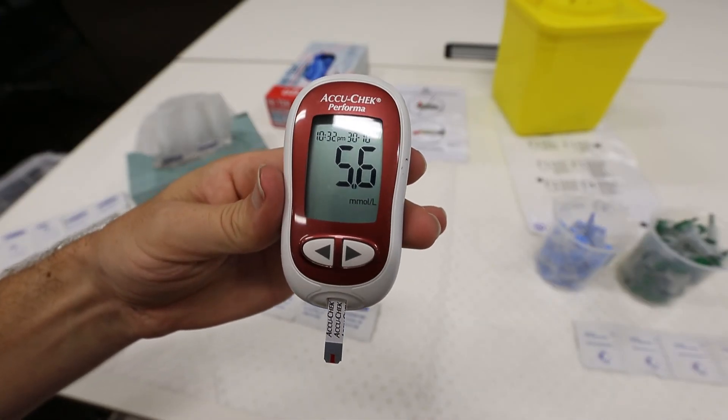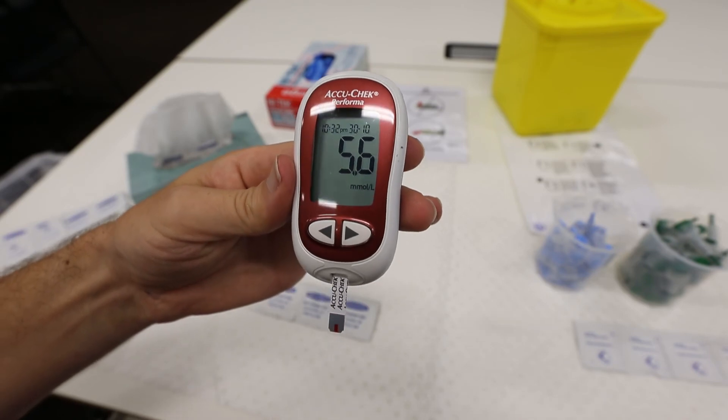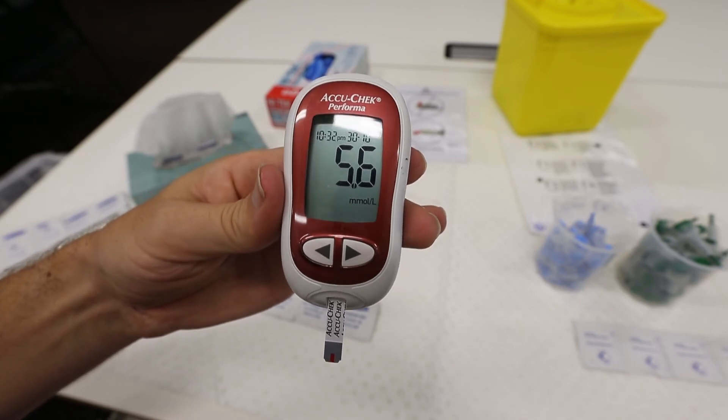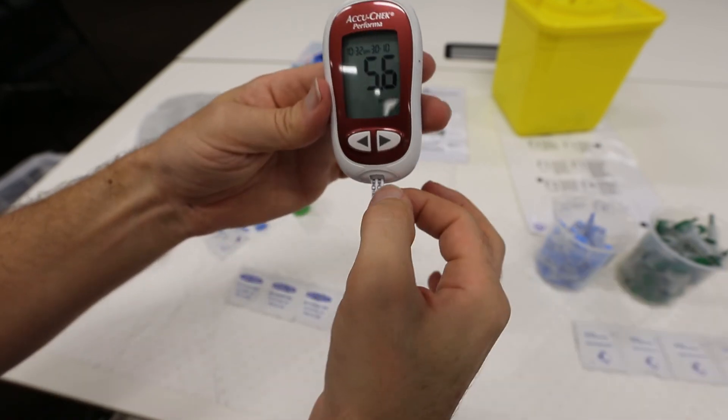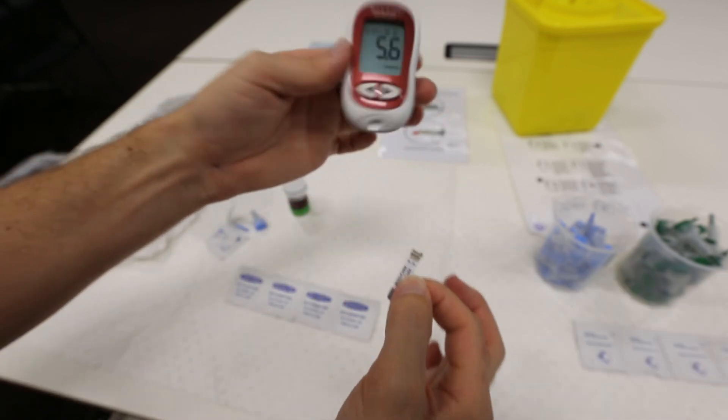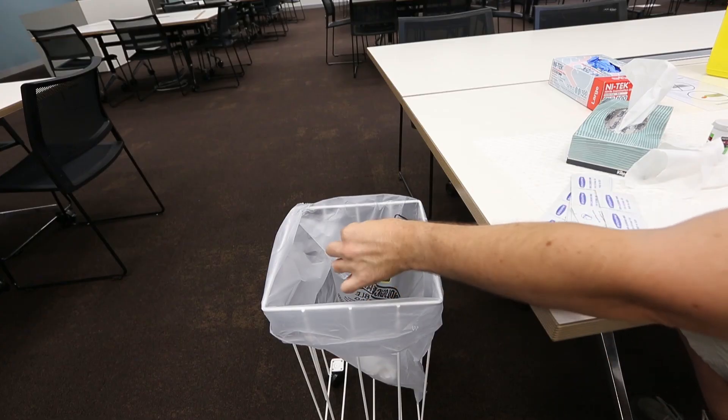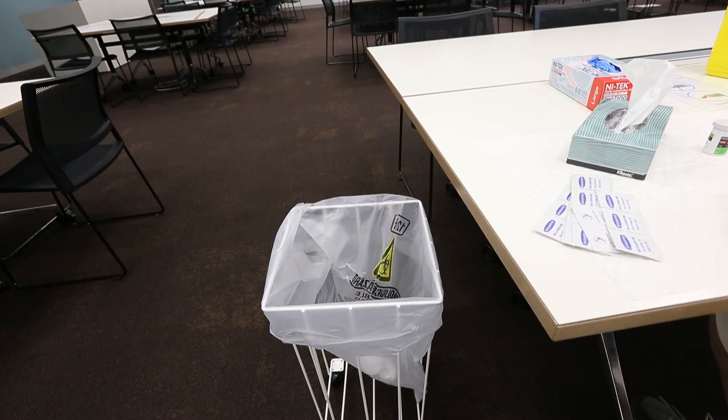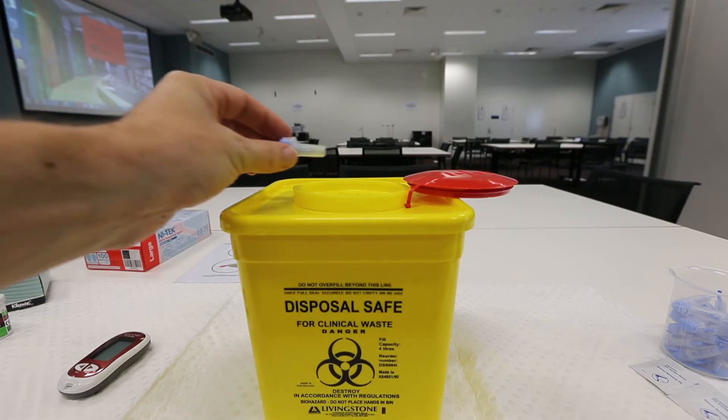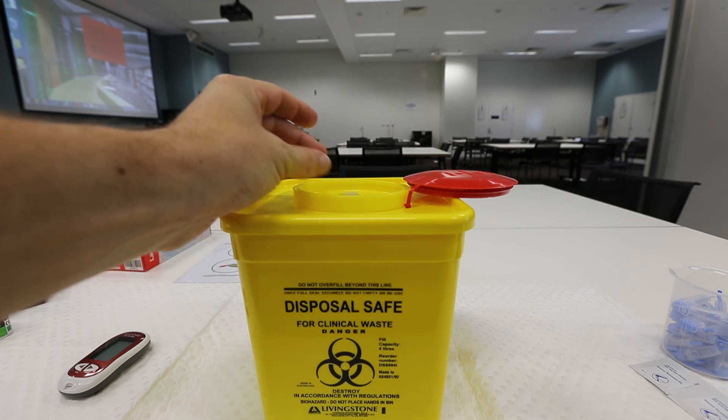Just be sure that you use the same glucose test meter for each of your measurements in today's class. When you are done, remove the test strip and place it into one of the biohazard bags which are dotted around the room. You can also place your tissues and alcohol swabs into these same bags.